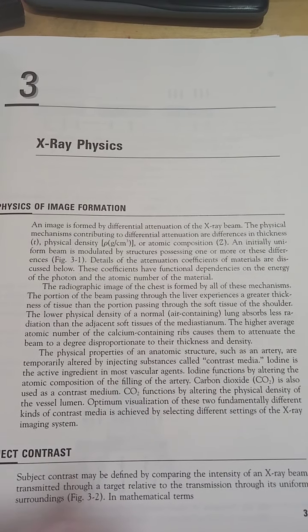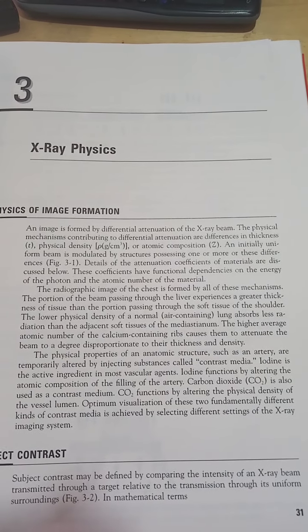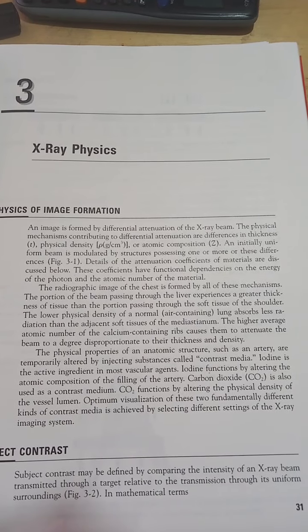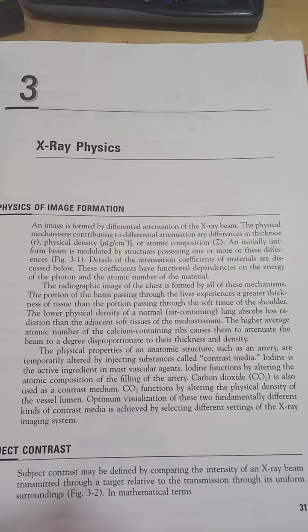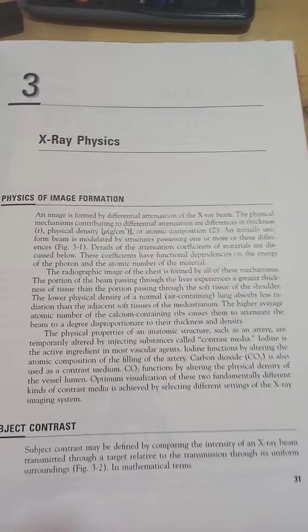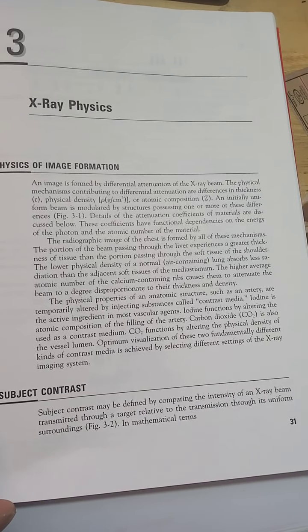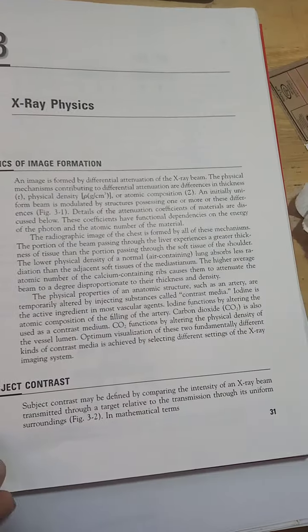CO2 is also used as a contrast medium. Surprisingly, I didn't know about that. It functions by altering the physical density of the vessel lumen, the vessel diametric dimensions. Optimum visualization of these two fundamentally different kinds of contrast media is achieved by selecting different settings of the X-ray imaging system. The subject contrast may be defined by comparing the intensity of an X-ray beam transmitted through a target relative to the transmission through its uniform surroundings.